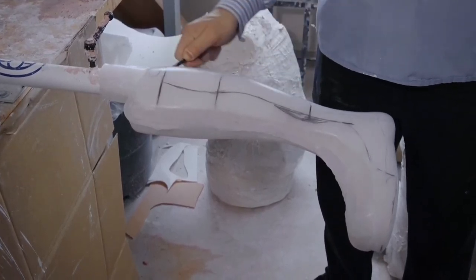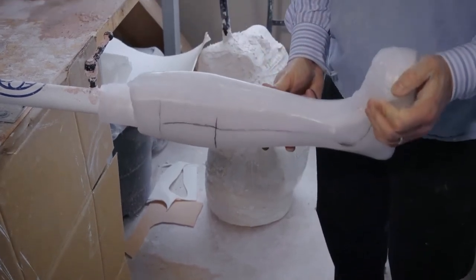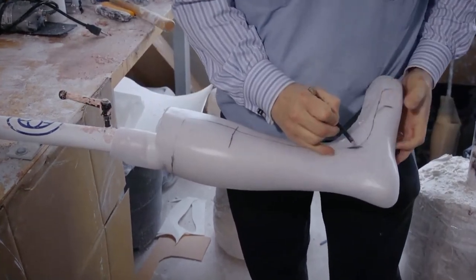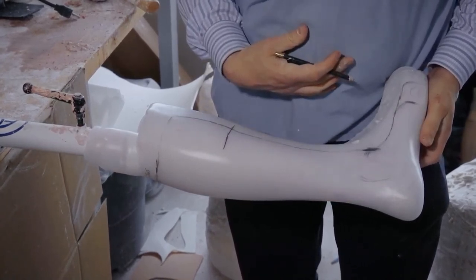So we're going to trim this out now, and we're going to probably trim out the audio as well later on. But this is how we kind of draw our trim lines. So remember, this is solid ankle in front of the ankle bone right here. Flexible is back here, and that's more for a patient with foot drop.